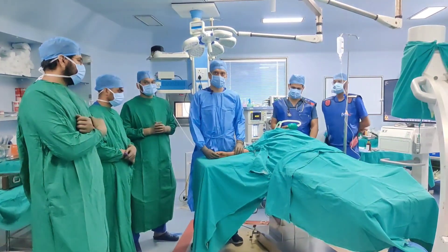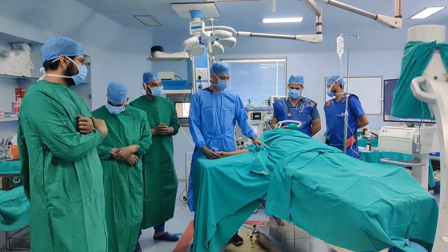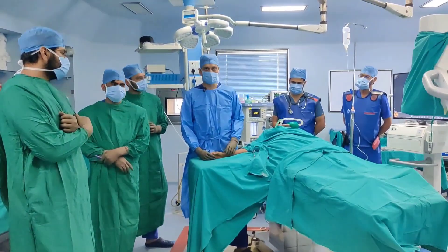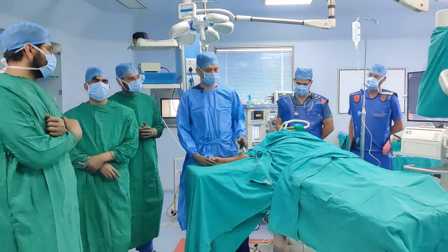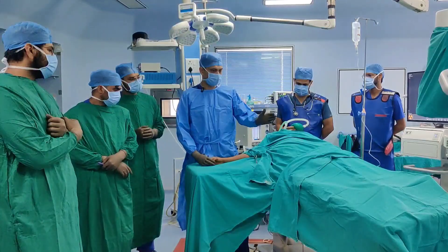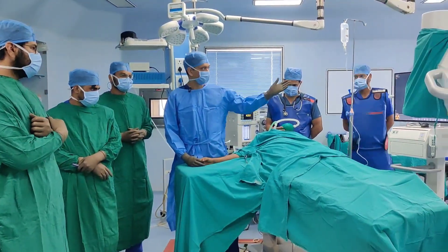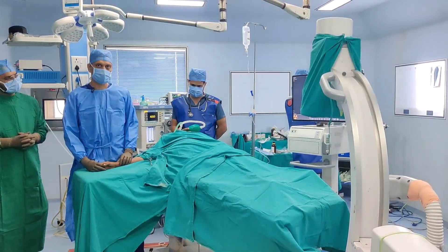This is our theater setup for this particular procedure. The patient is supine and we have kept the tourniquet on, though you do not need a tourniquet because you are not planning to open it up. However, there are occasions where pronator quadratus can be interposed and you may have to open, so it is a good idea to keep the tourniquet on in case you need to inflate it. I have angled the table slightly, and the C-arm is going to come from the front with my image screen positioned so I can have access to the images all the time.